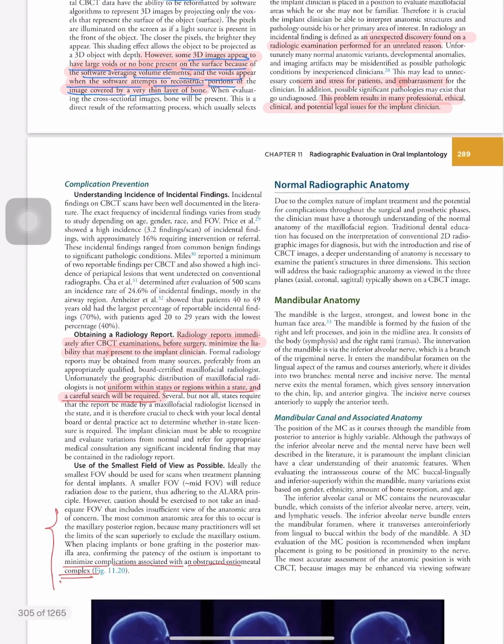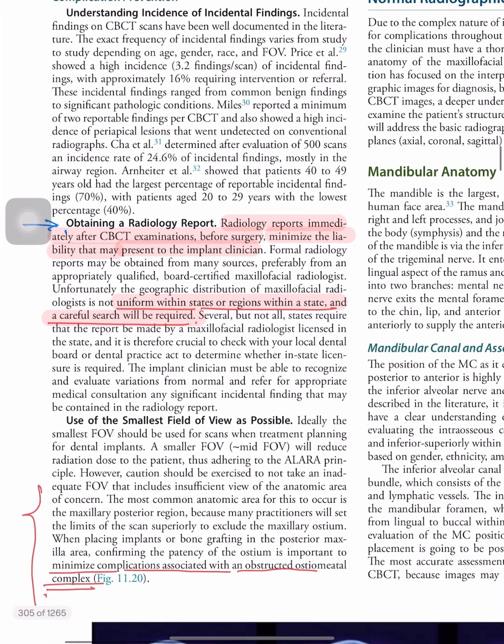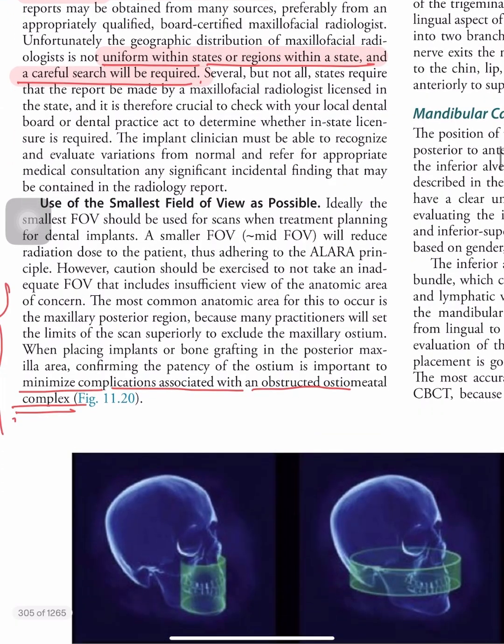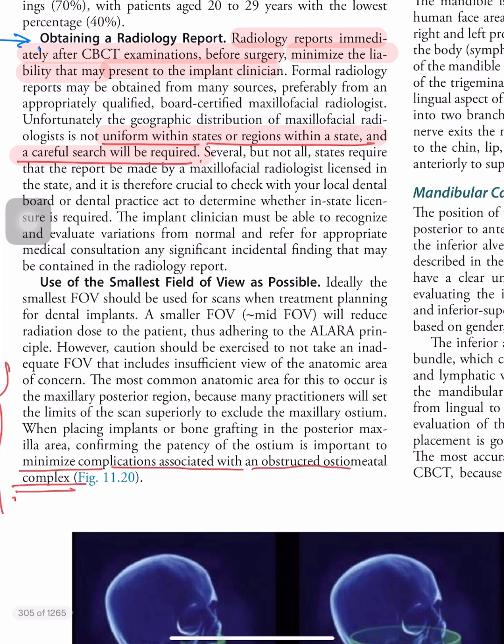How do we keep ourselves safe from such incidental findings? First thing is, when you notice a certain finding, obtain a radiologist report in writing. In that way you will be legally safe. I would also recommend that if you know any oral or head and neck radiologist, you send the report to them for a better evaluation.